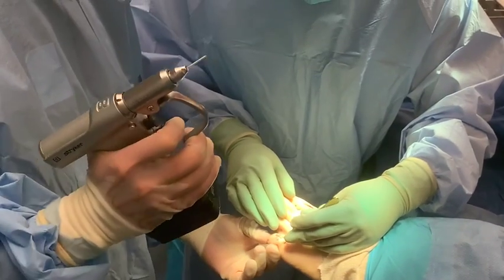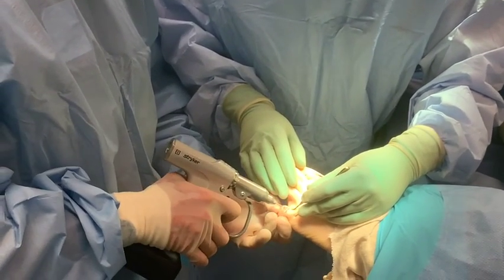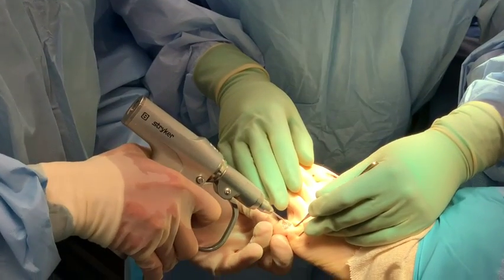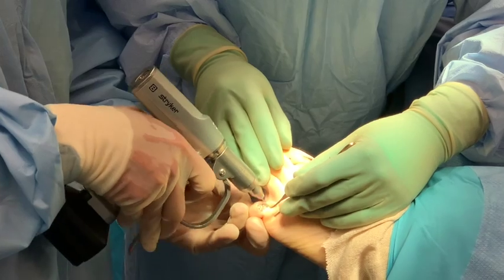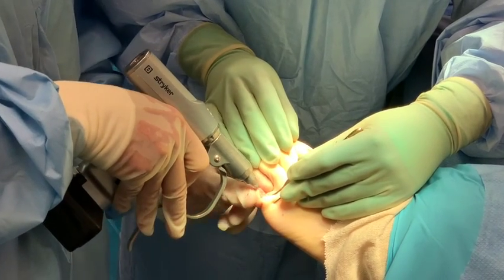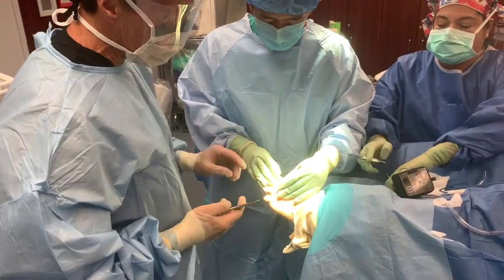Now we're going to actually insert the pin. You can see I put it in the driver, a little bit of pressure, it goes down the proximal phalanx medullary canal — give it a little blast. The key is to get it to bottom out at the proximal phalanx base, because we don't go out the tip of the toe.